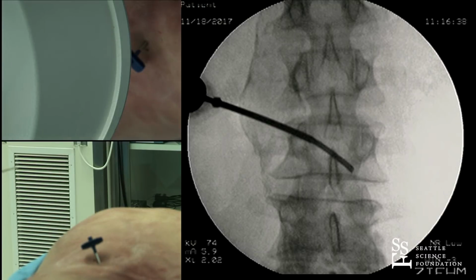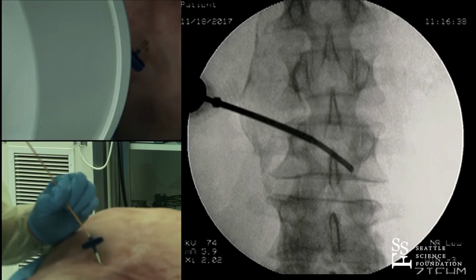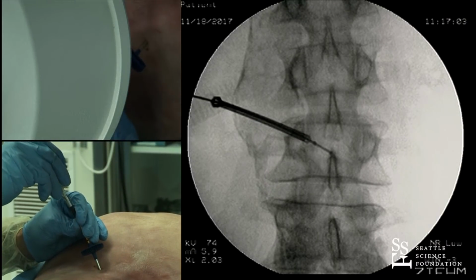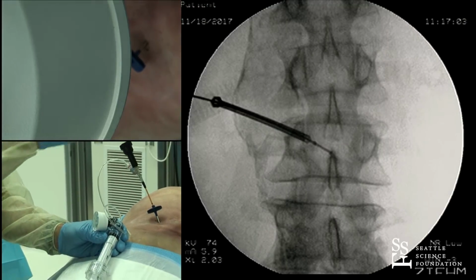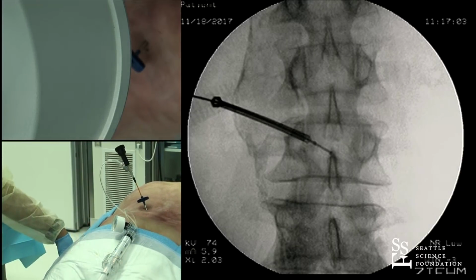Thank you, Jason. All right. Okay. My question was in the audience, how many millimeters is the balloon? The balloon we have here is a 10 millimeter balloon. And we have different sizes. Let's go lateral. But this is one that was just delivered, I think.